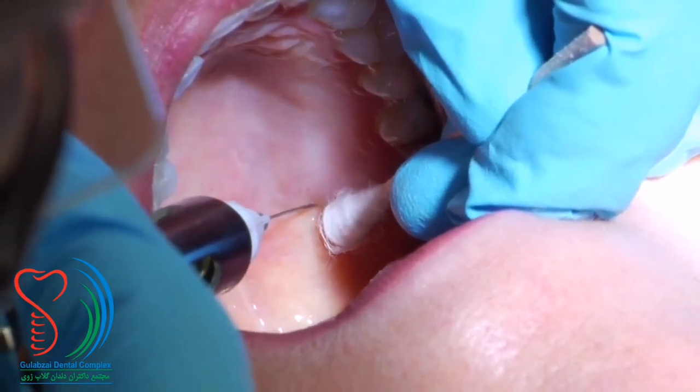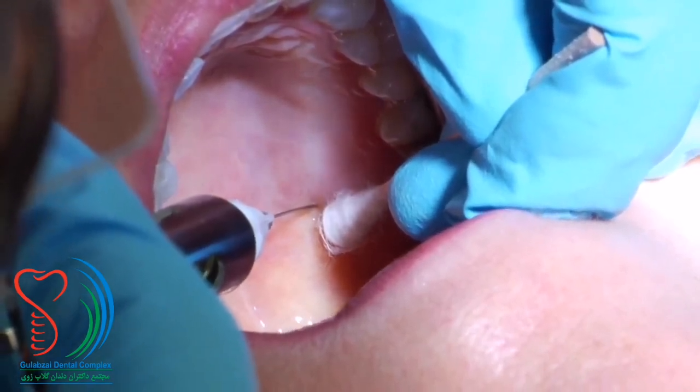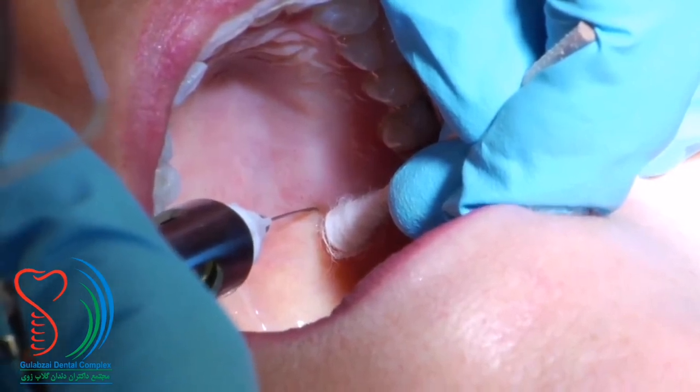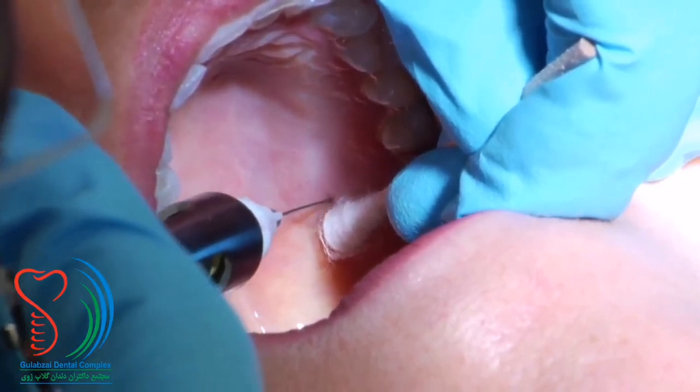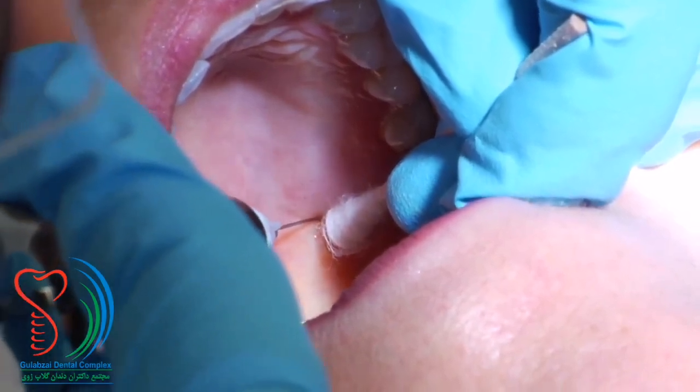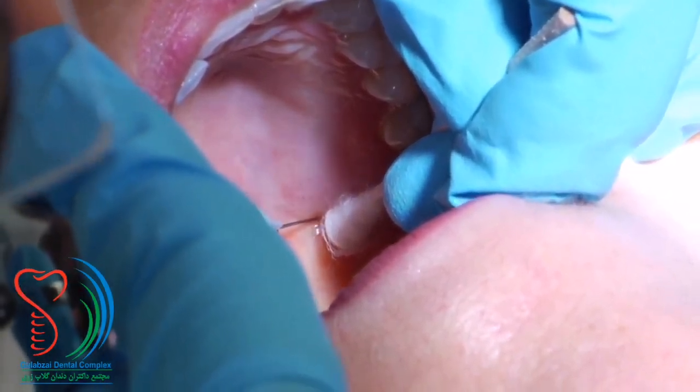This is a shallow injection, and with the 1/4 inch depth, you will meet resistance quickly. After a negative aspiration, very slowly deposit approximately 1/4 of a carpule with multiple aspirations.